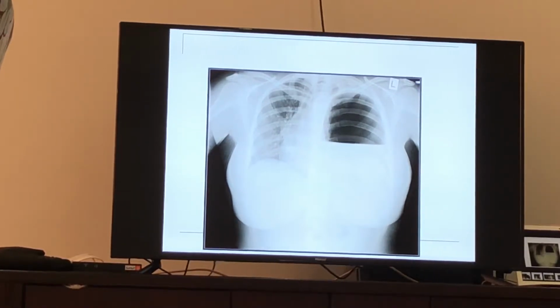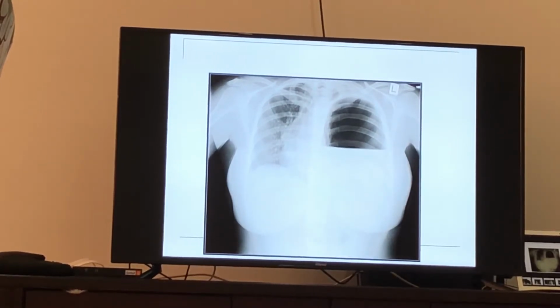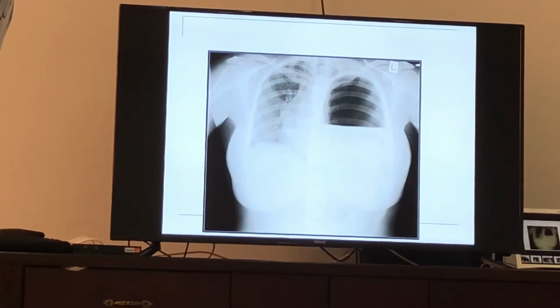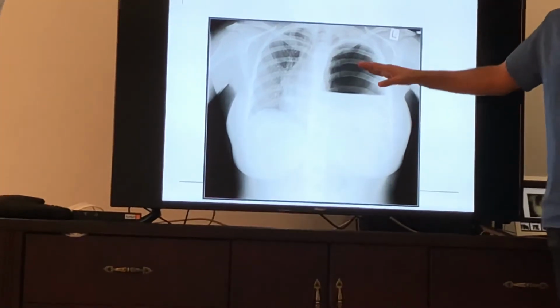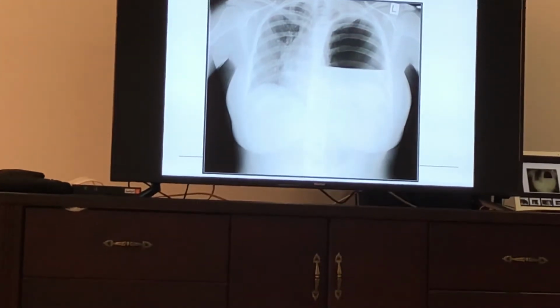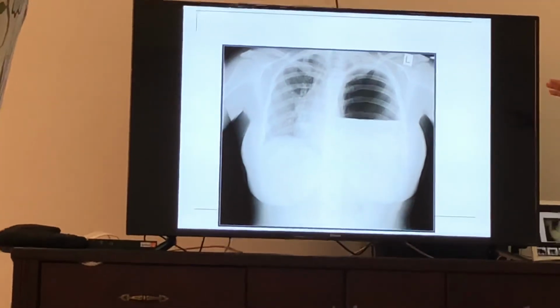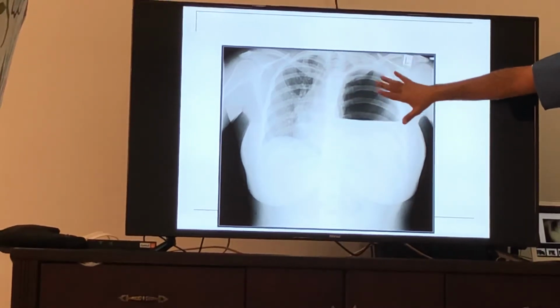Hydropneumothorax. So why do you say, is it right or left? You must say left hydropneumothorax. So there is left-sided hydropneumothorax alone? No, you did not complete. So what you're describing is that the left side has air and fluid in the pleura. Don't forget, you did not finish off. When you tell me there's mediastinal shift or not, I will ask you, but you should catch it. So yes, you're right. The pathology on the left is pleural, it's hydropneumothorax.